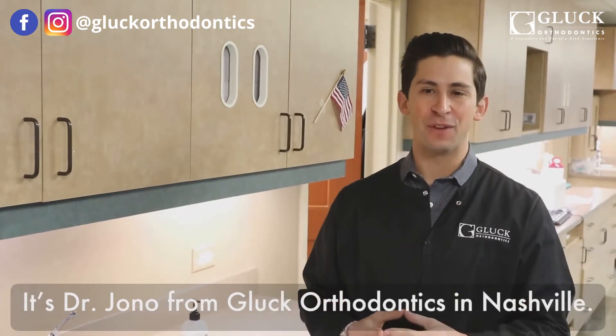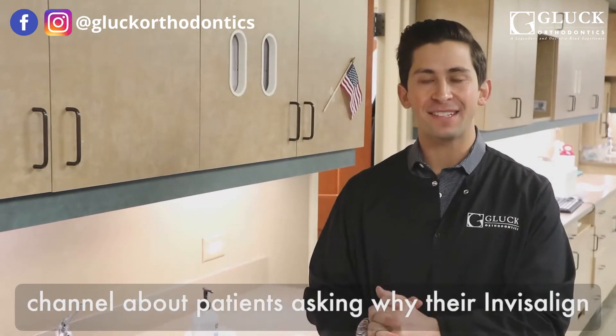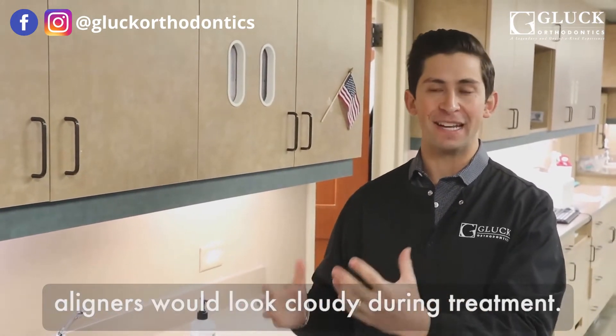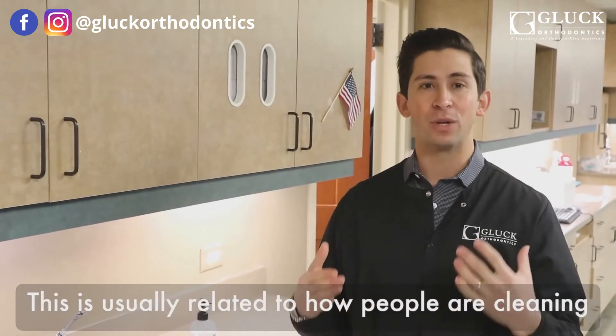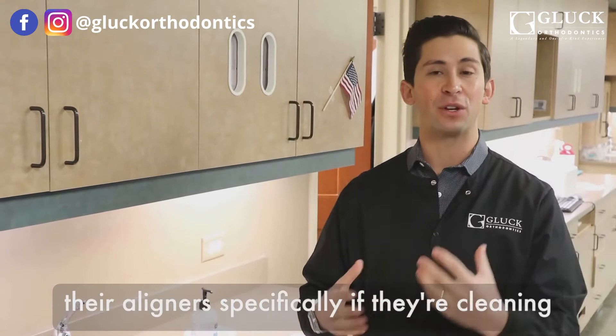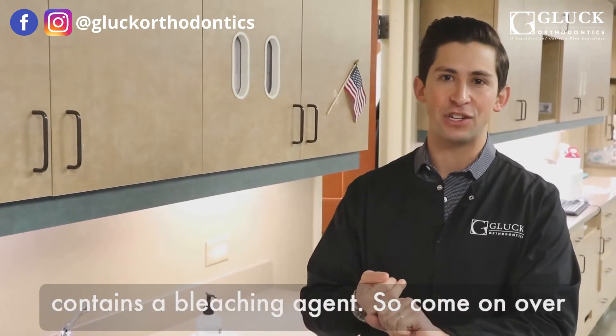Dr. Jono from Gluck Orthodontics in Nashville. We get a lot of questions through our YouTube channel about patients asking why their Invisalign aligners would look cloudy during treatment. This is usually related to how people are cleaning their aligners, specifically if they're cleaning them using a toothpaste, especially one that contains a bleaching agent.